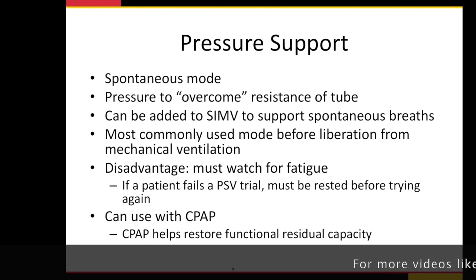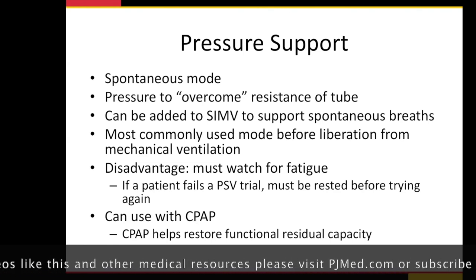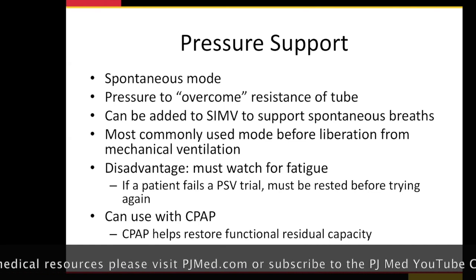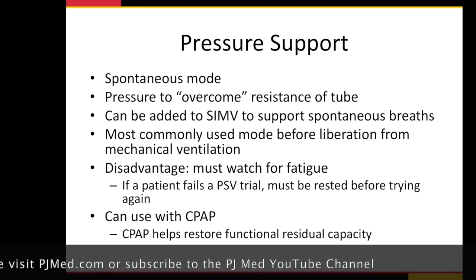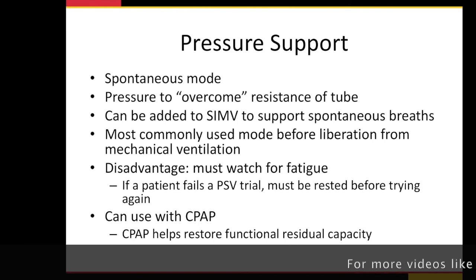You can add in CPAP or PEEP, whatever term you want to use. And that can actually help. So you keep the back pressure, and then when you add in the pressure support, they take a breath, and then the back pressure is just the PEEP that's left in the circuit to keep that circuit charged with the pressure so that their lungs don't do this and collapse.